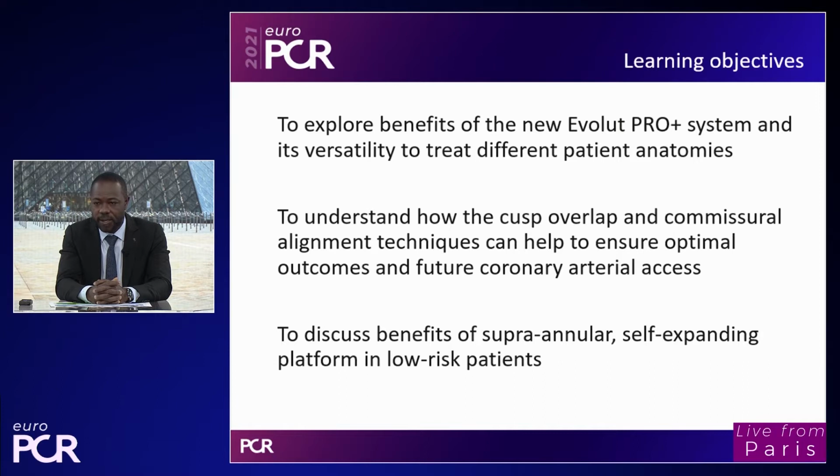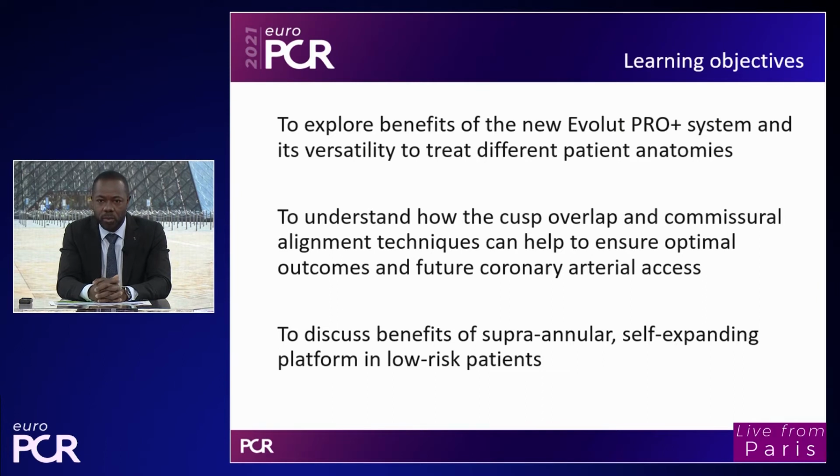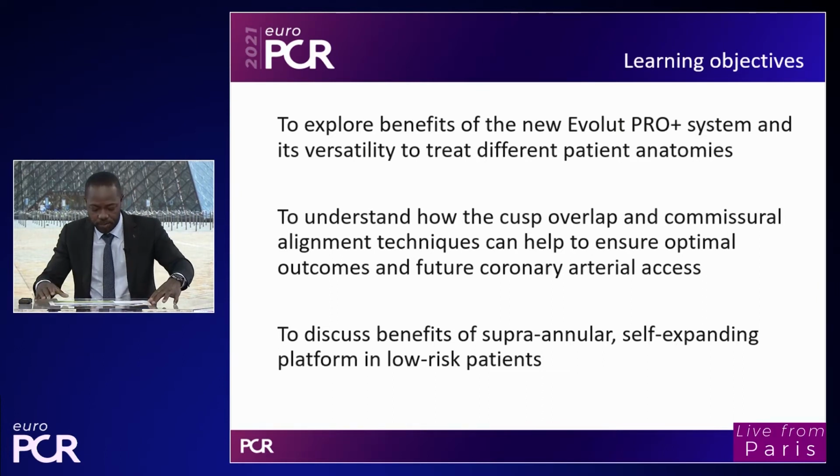And lastly, we will discuss the benefits of that self-expanding supra-annular platform in low-risk patients, because this is one of the last indications, apart from bicuspid patients. The low-risk indication is one of the most recent indications for TAVI in general.